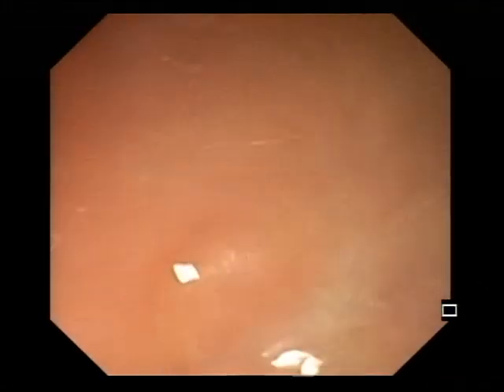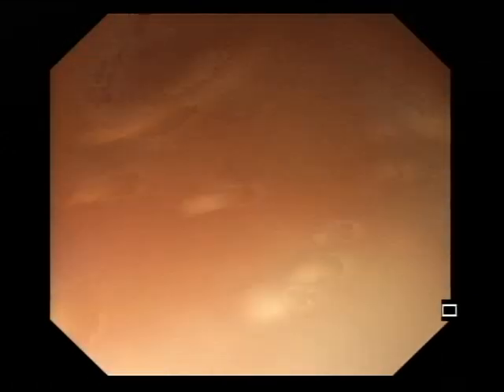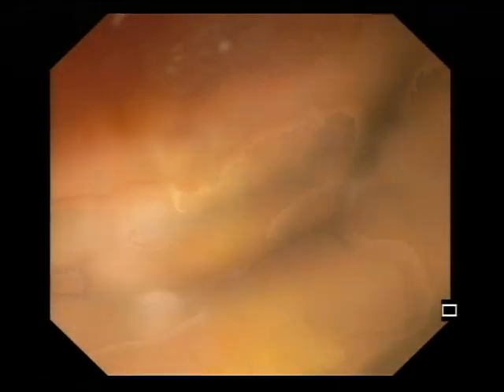So what I'm going to do is let's see if I can go further deeper in there, and if I can, I would like to go a little further up. Because of the linear scope, you have to be careful while advancing. We are moving nicely. I think I'm pretty high up there now. My scope is close to 25 or so, so I think that should be enough.